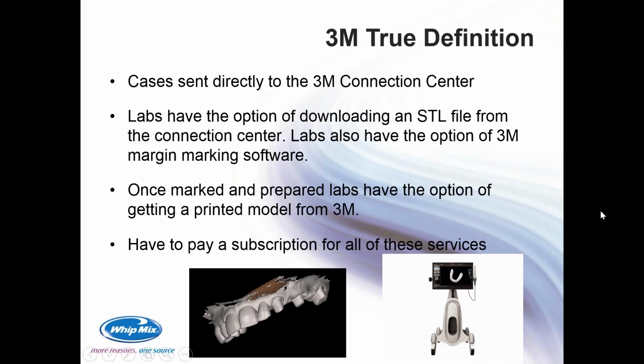So some key notes, starting with the 3M True Definition. With the 3M True Definition, you should know that cases are sent directly to the 3M Connection Center. You have the option of downloading an STL file from the Connection Center.